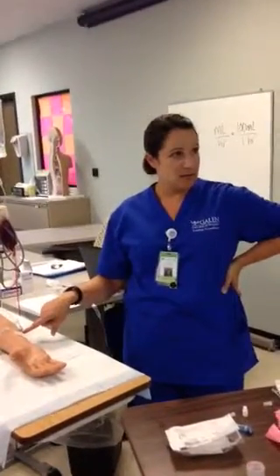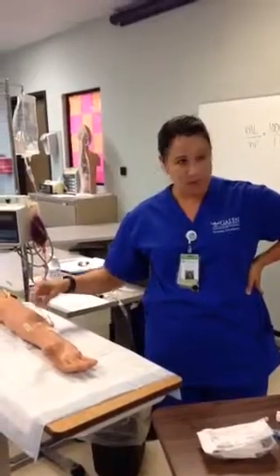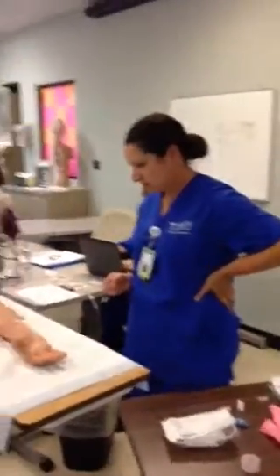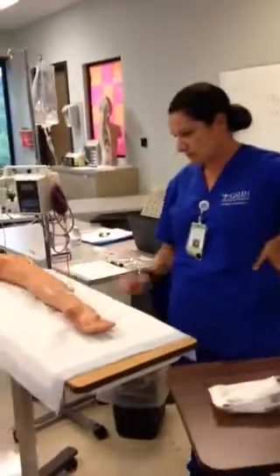Do you mean would it be wrong if you had tape like from this up here? Well, like yesterday, when a lady started the IV in clinical, and she taped here afterwards, so it couldn't be pulled out. I'm just asking. In CPE, this is what we should do.